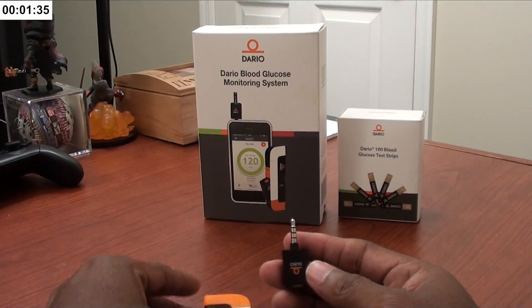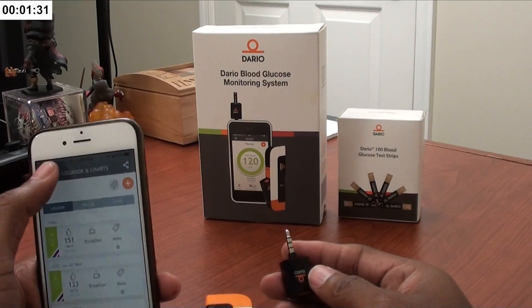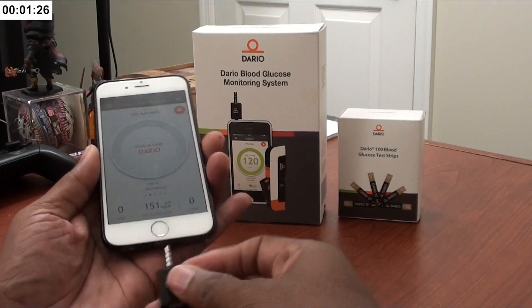Here is the device that actually connects to your iPhone, tablet, or Android. You have to download the accompanying app — I've already done that and have the app open. So let's take a reading real quick so you guys can see how it works.